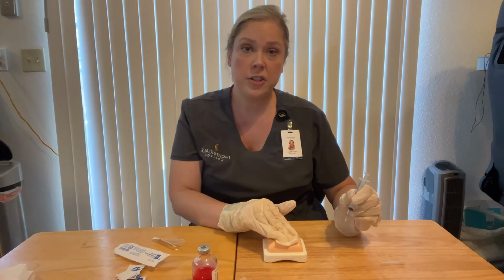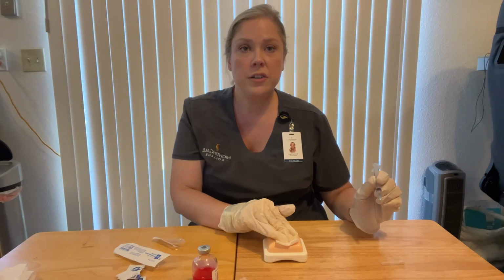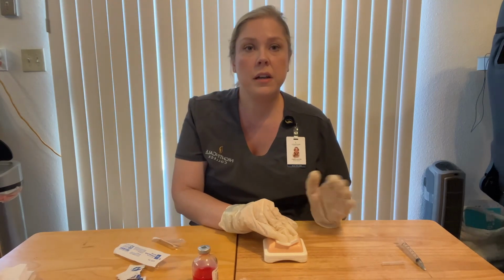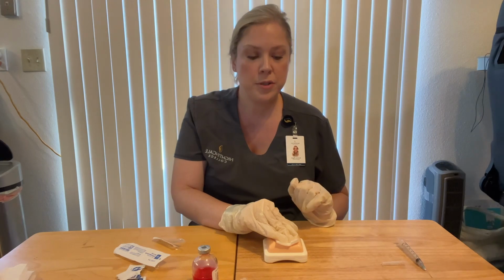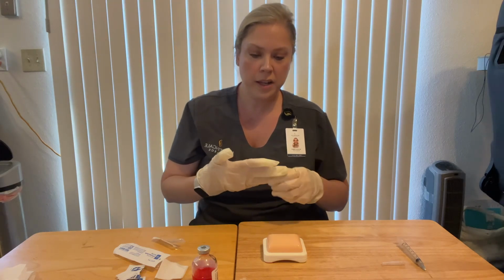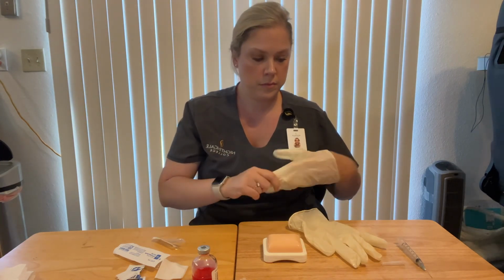We do not want to massage the area. I'd want to toss my needle and syringe into the sharps container. I'd apply a Band-Aid if needed. Again, I would not put the cap back on. I would just dispose of both in the sharps container, remove the gauze, doesn't need a Band-Aid. I would remove my gloves, perform hand hygiene, and then I would go ahead and document my procedure.